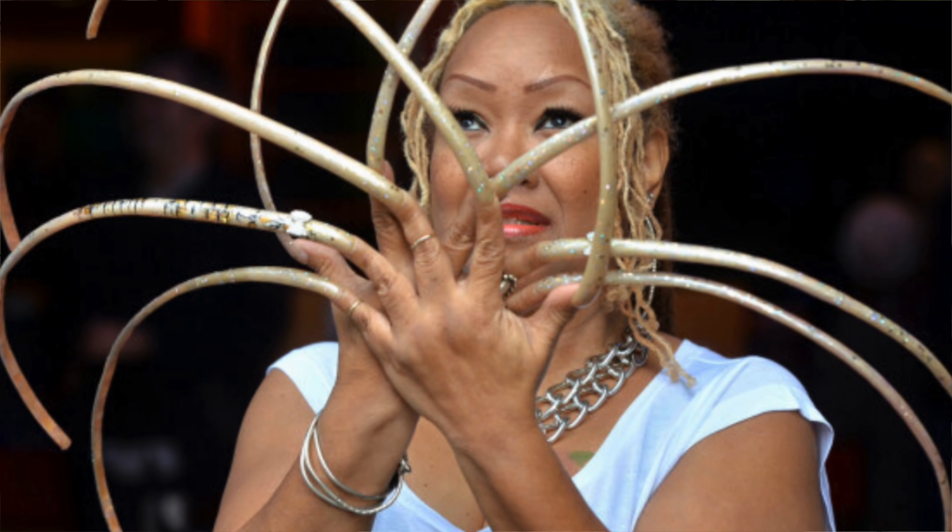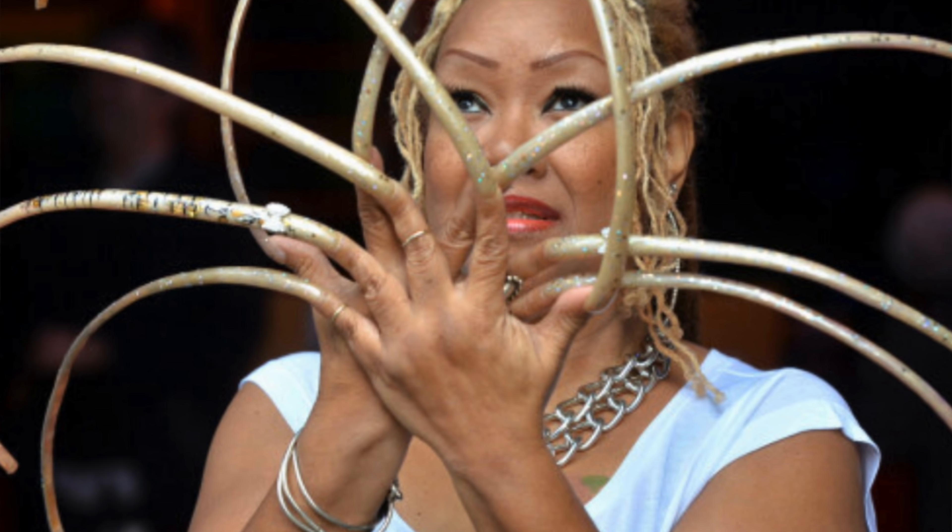The second most common reason people tear their contacts is having long fingernails. It's very hard to position your fingers to pinch the lens in and out without the long fingernails tearing them. I usually ask patients with longer nails to keep their index fingernail the shortest. Most women don't like me telling them to cut their fingernails, but it really does make it a much safer way to put contacts in and out.